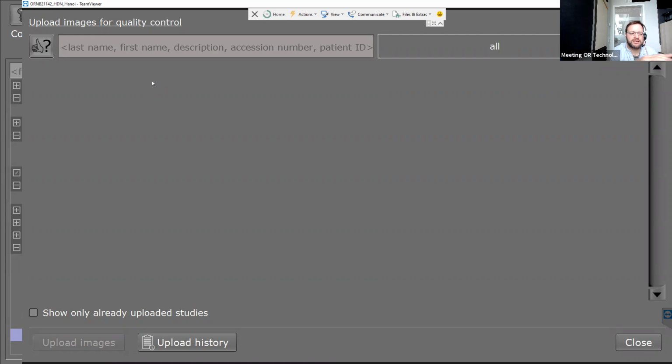And you can give us a description. For example, the customer thinks that the images are not sharp enough, or the customer thinks that the images should be not so sharp, or maybe with less contrast, or whatever the customer needs to have his perfect images.